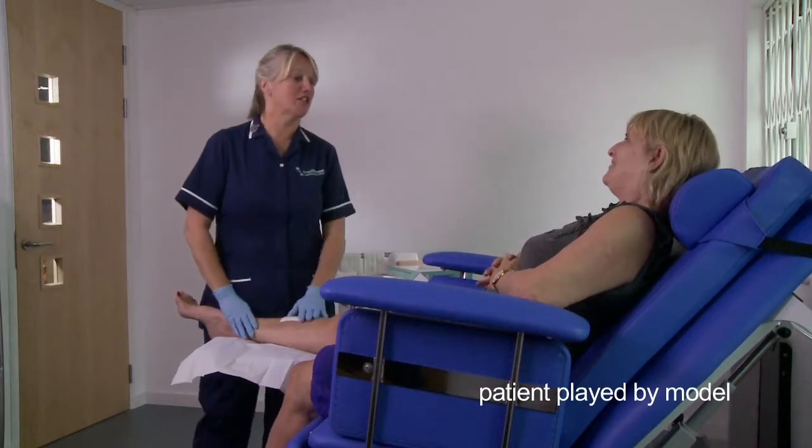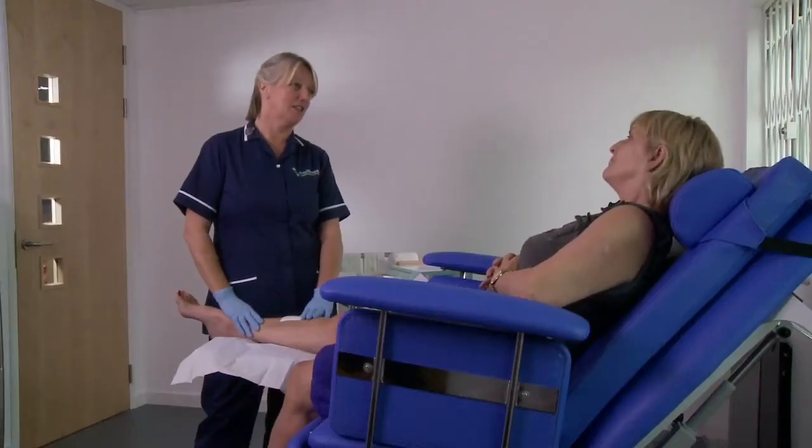This instructional film is designed to take clinicians through the application of Axel Heal alongside the patient's standard wound care regime including compression therapy.